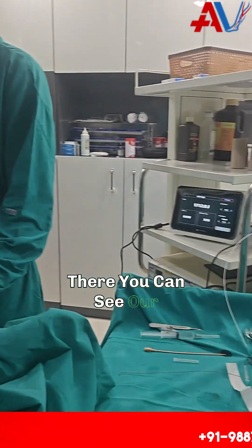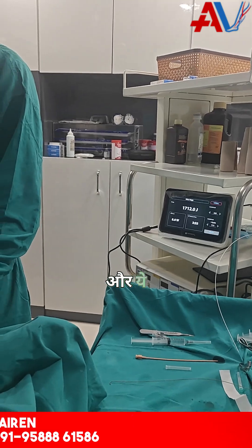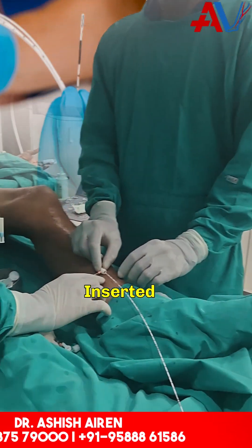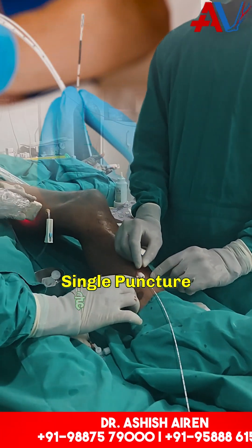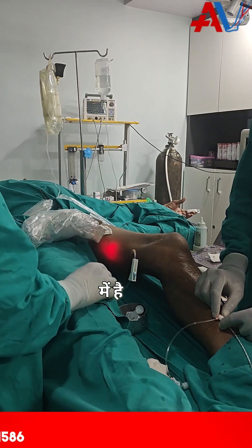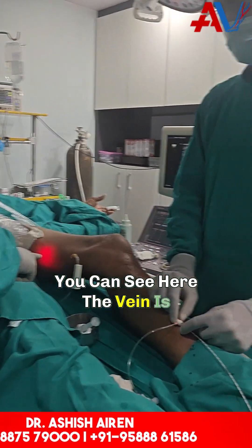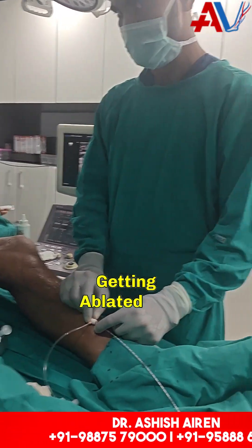There you can see our laser machine. This is the laser fiber inserted. It is a single puncture. The patient is under completely local anesthesia. You can see here the vein is getting ablated.